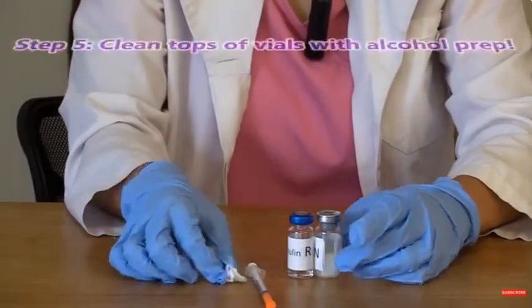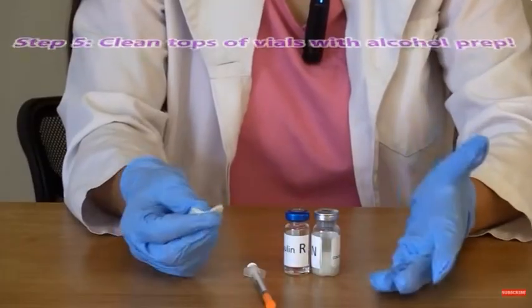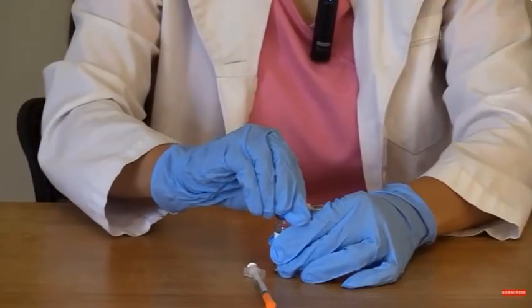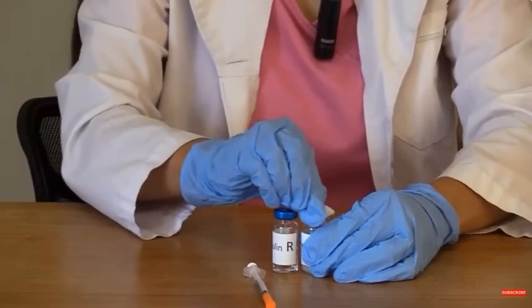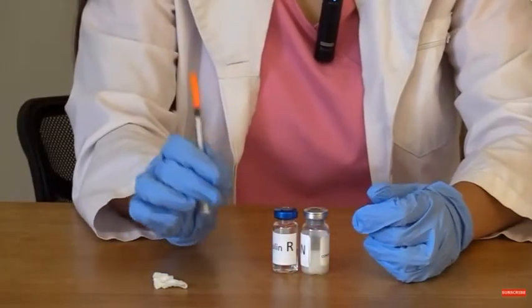Next, we're going to take our alcohol prep and clean the tops of these vials to get rid of germs. We're just going to clean for about 5 to 10 seconds, really good, each vial. And then we go to the next vial and clean that. And now we are ready to use our syringe.